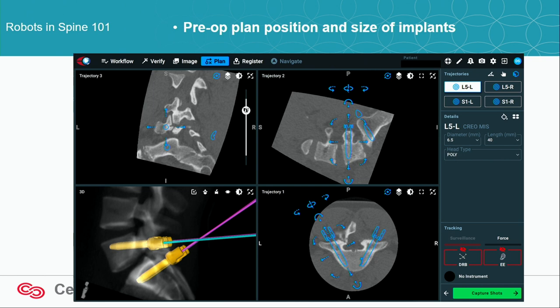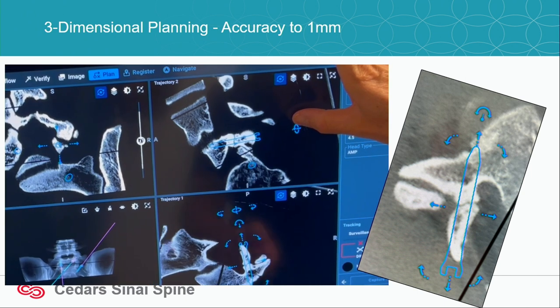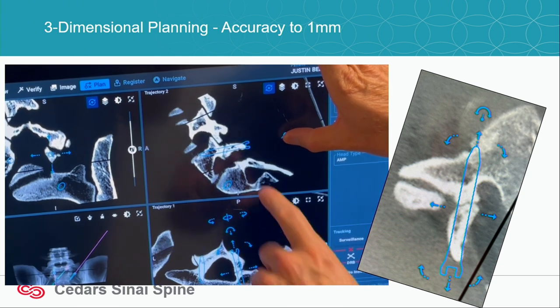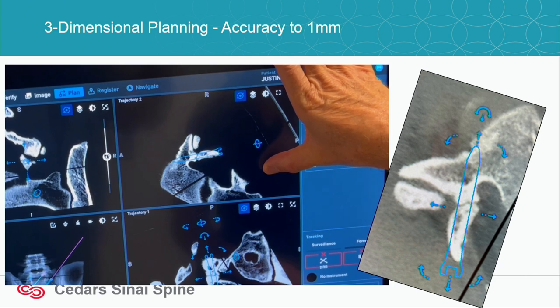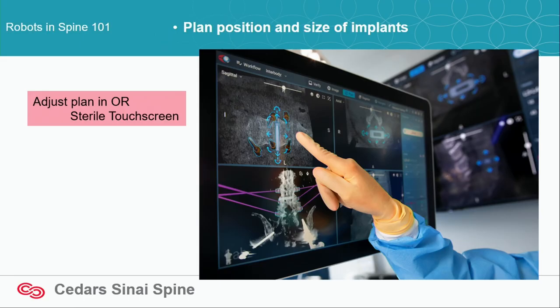And robots allow amazing planning. If you do the pre-op CT, you could sit there for days with your partners. You can think about things. It's a great teaching tool, and I think it allows us to be more precise. I think it allows me to be more precise. And it gets to the point where you could actually spin a spine around a screw to make sure that, for the spondy repair, you're not touching a joint above or below, you're not going to touch the nerve. I can't believe I used to shoot these things in by hand. I wonder how many times I hit joints and didn't know it. And it's kind of cool.